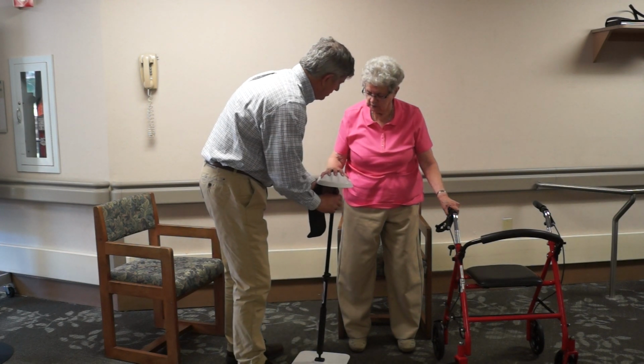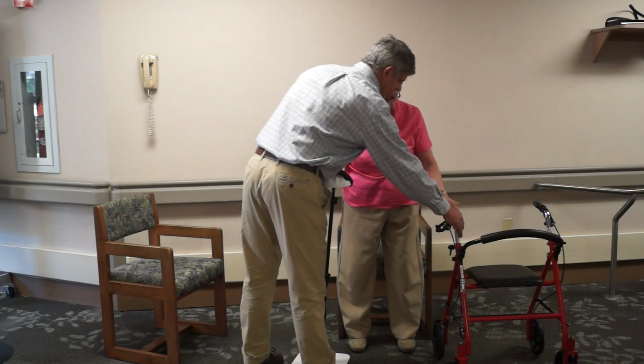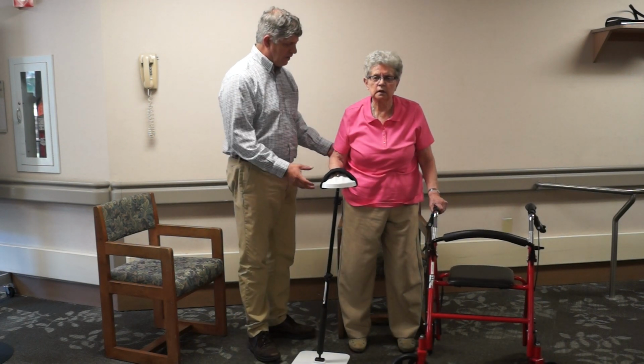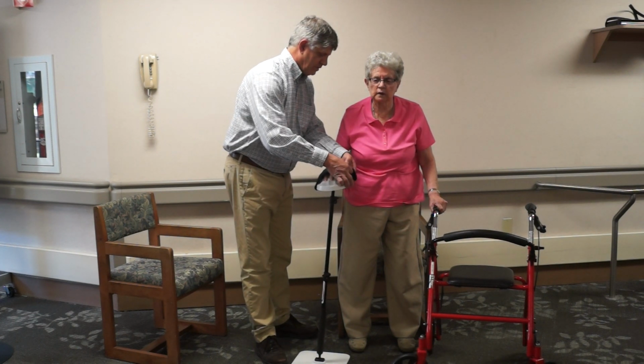Just a hair lower, just so. Okay, so just remember to let the tool hold the weight of your arm, okay? All right. Does that feel like a good place for you? Yes, yes, very good. Okay. All right. So now, let me ask you to bring your hand just a little bit more into it. There you go. All right, all right.